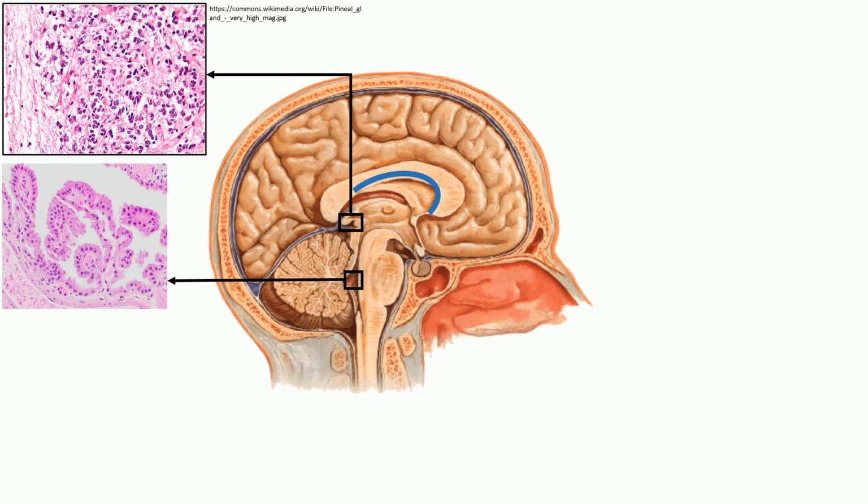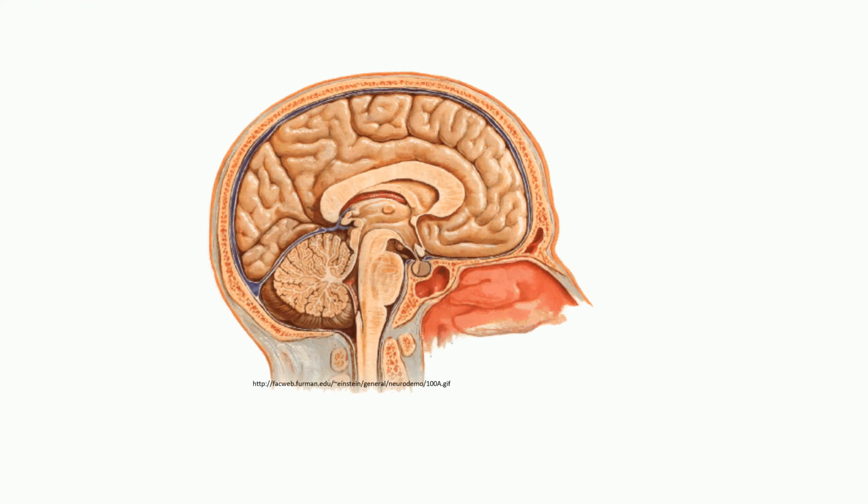And so that's one of the considerations in the differential diagnosis of a tumor located very close to the posterior aspect of the third ventricle, that the biopsy tissue might actually represent normal pineal gland that very much looks like tumor.